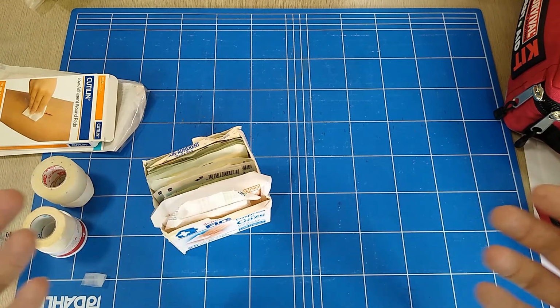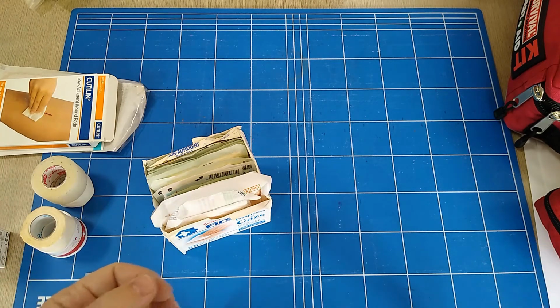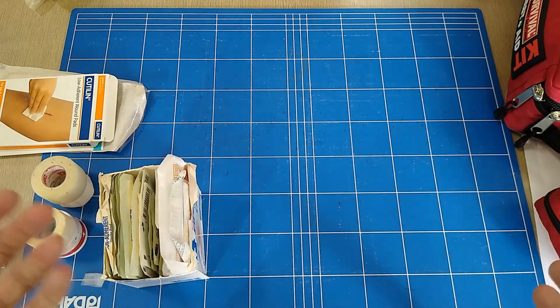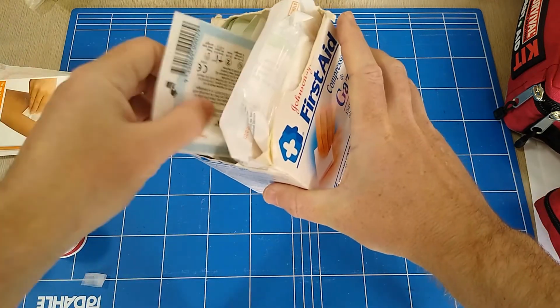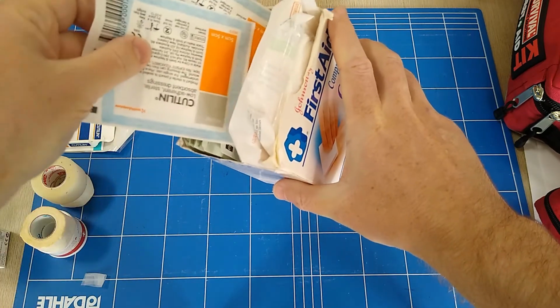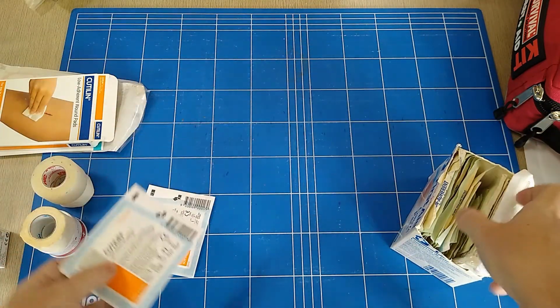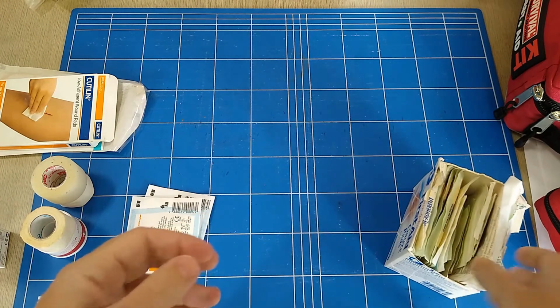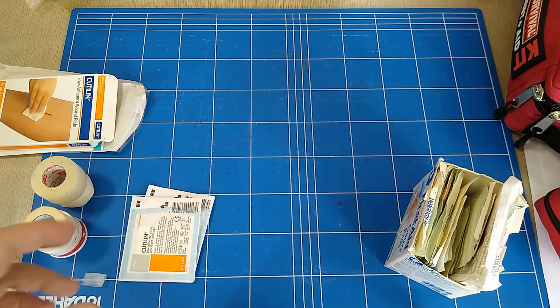And everything is covered in kind of gunk anyways, so you're not really adding anything if it's clean. So for me, that's where you go with the cheaper stuff, get it in the bulk pack, because ultimately you don't want to use that directly on a wound. You always want something that is an actual low adherent or non-adherent bandage. That's going to have a bit of a coating, like the surface of the pad of a Band-Aid, to keep it from sticking.